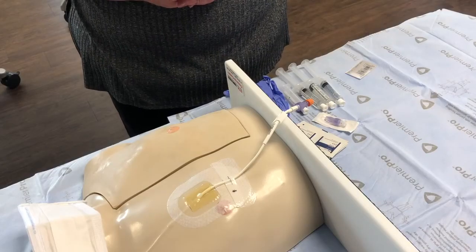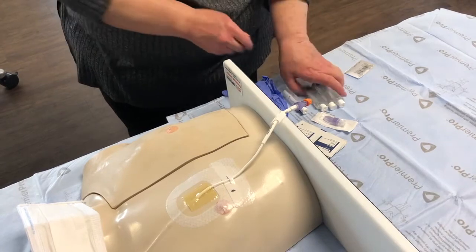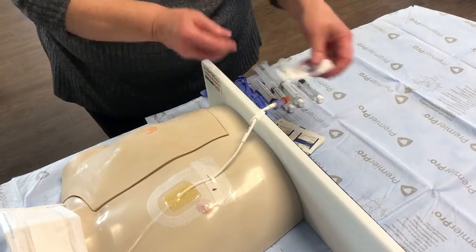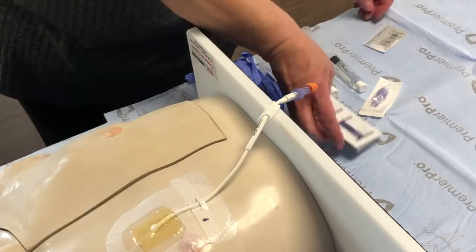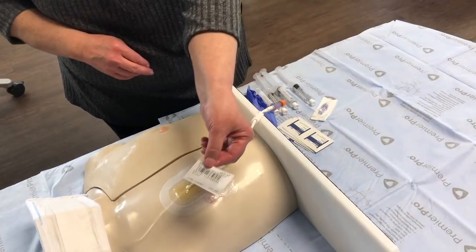This is a demonstration of a central line blood draw and hub change. Obtain saline flushes, empty syringes for specimens, new positive pressure hubs, antiseptic wipes, gloves, blood specimen tubes, transfer device, and specimen labels.